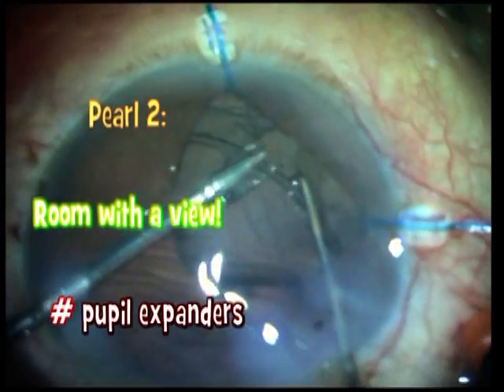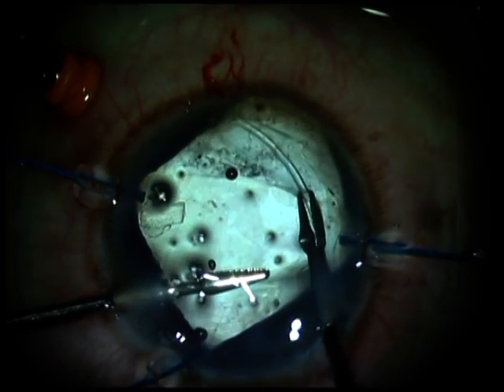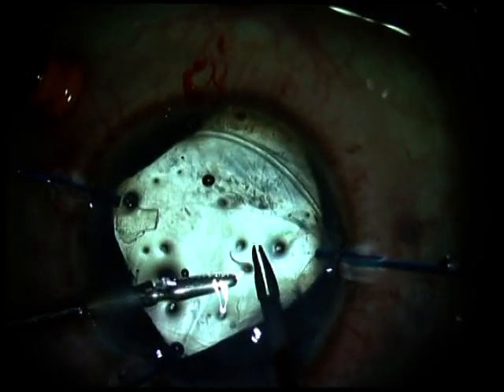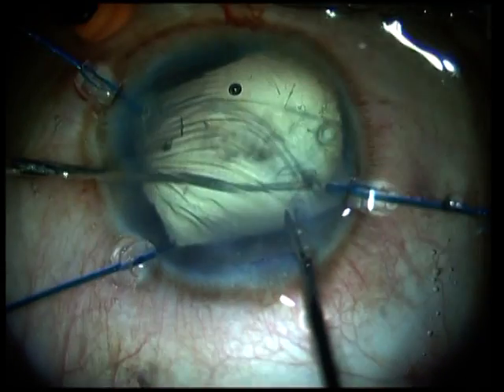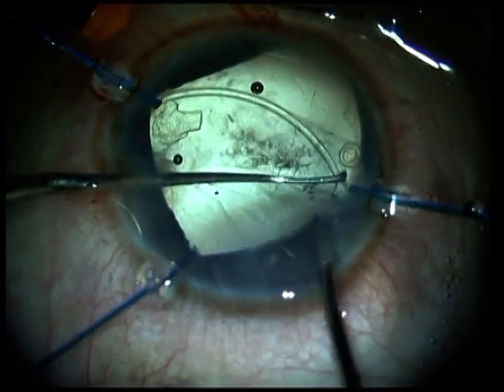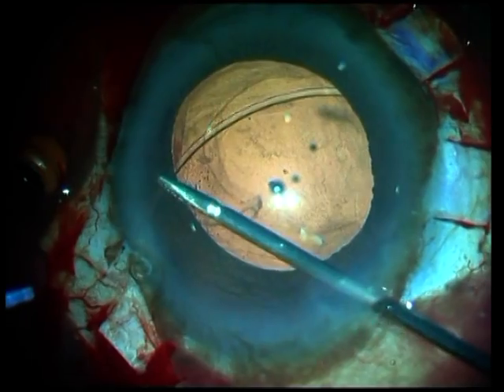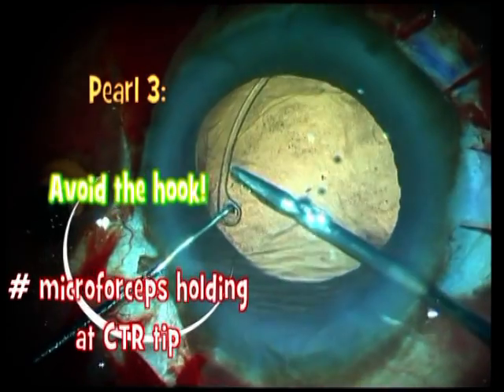Get yourself a good view before putting the CTR in, if necessary by using pupil expanders. Do not use a Sinski hook for dialing the CTR in. Instead, use micro forceps and a messy situation like this can be avoided. This is my pearl number 3 — to use micro forceps, which gives you a much more controlled technique to implant the CTR.